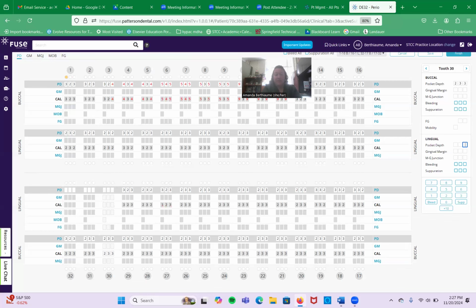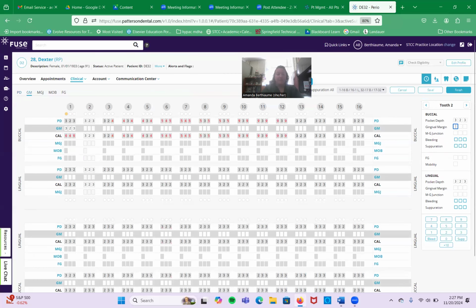After they do the periodontal numbers, they will then give you the gingival margin. So the gingival margin will have 3 numbers, but the only number they might give you is 1 on the buccal surface. If the tooth has recession and has direct access to the mesial or distal, then we can record it. So say there is tooth number 2 in the mouth, but 3 is missing and 1 is missing. You might find recession on that mesial aspect and you would put it in there, or the distal aspect, right? So that means mesial, facial, distal on these numbers.